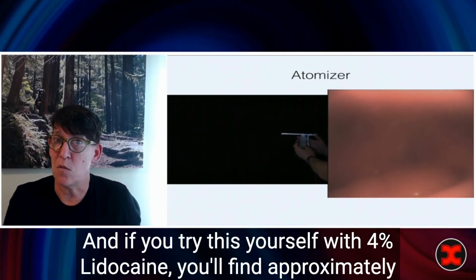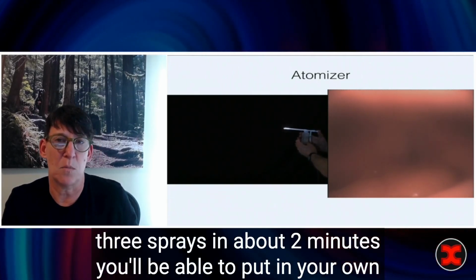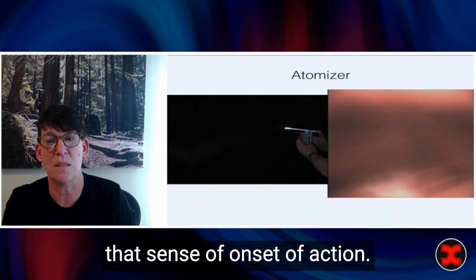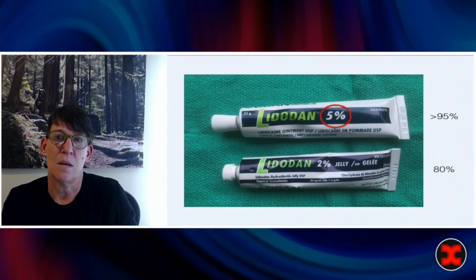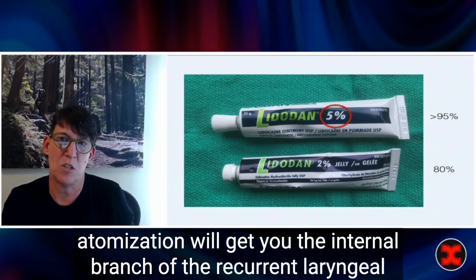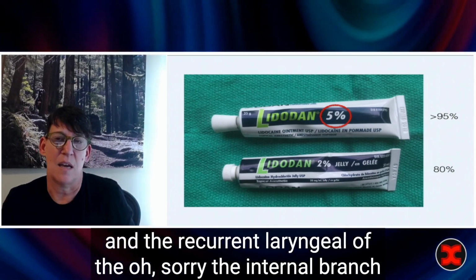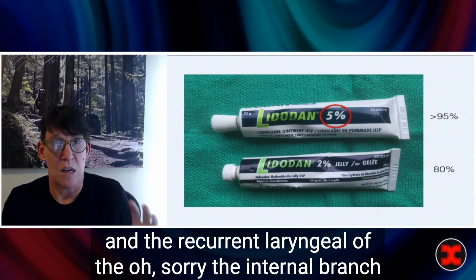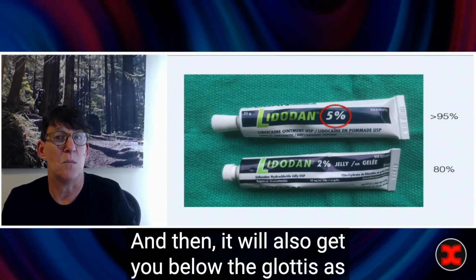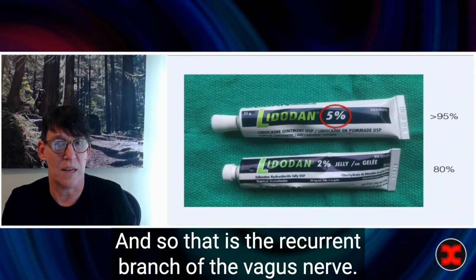And if you try this yourself with 4% lidocaine, you will find approximately 3 sprays in about 2 minutes, you'll be able to put in your own oral airway. And I'm not kidding you. Consider doing it just to have that sense of onset of action. So in terms of how to get glossopharyngeal, the atomization will get you the internal branch of the superior laryngeal, which is part of the vagus nerve. And then it will also get you below the glottis as the patient breathes it in. And so that is the recurrent branch of the vagus nerve.